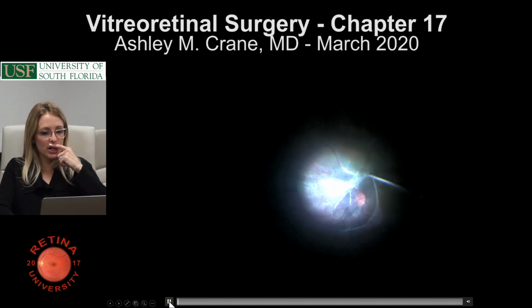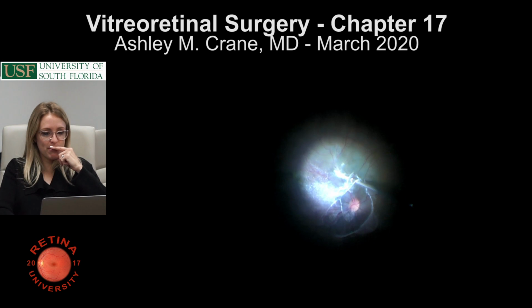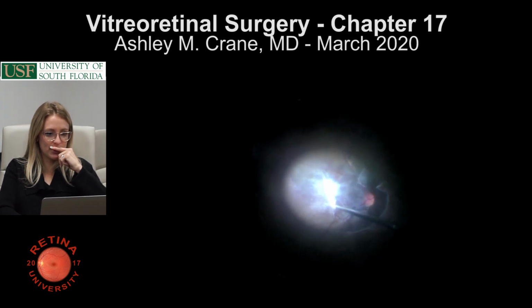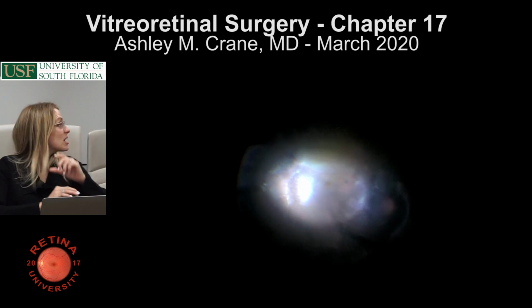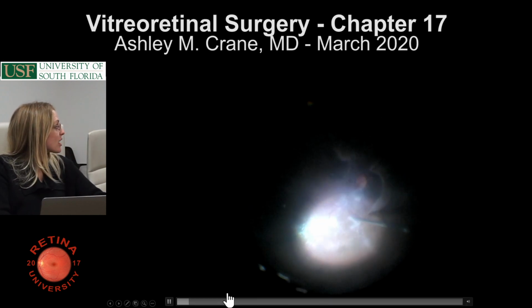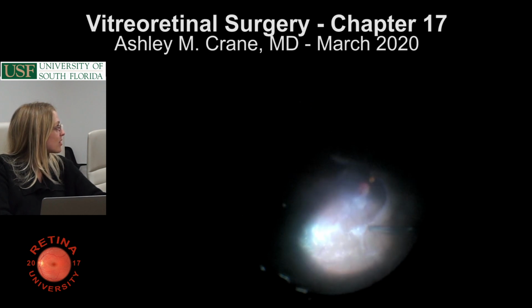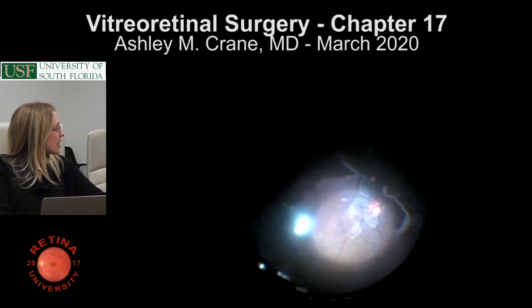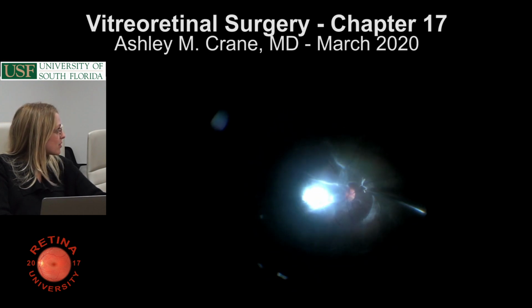Okay, so here is a video of lifting the hyaloid. I think that this shows you really what the hyaloid looks like. So it's stained with Kenalog here, or triamcinolone, and basically it's being just lifted off. And you can really understand the anatomy when you see it coming off.